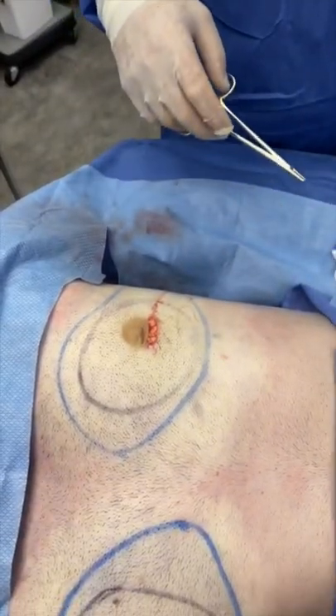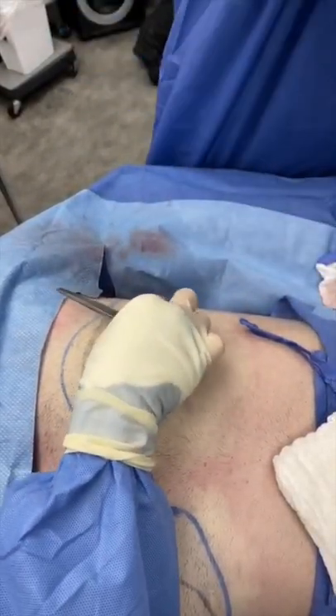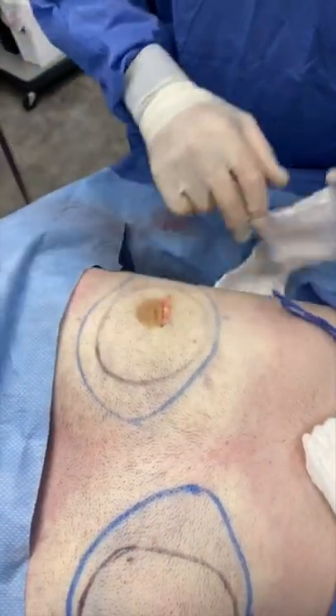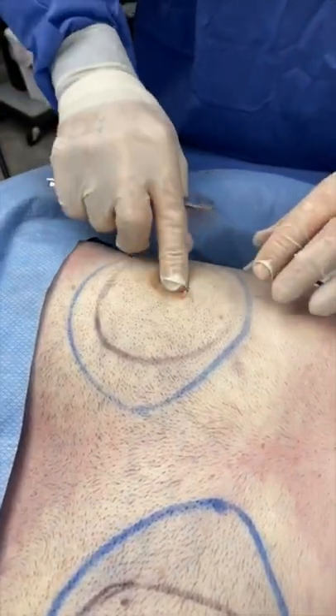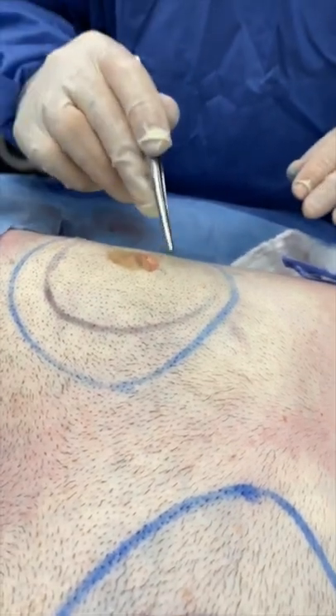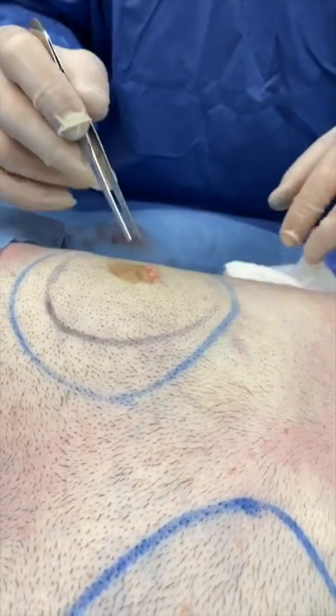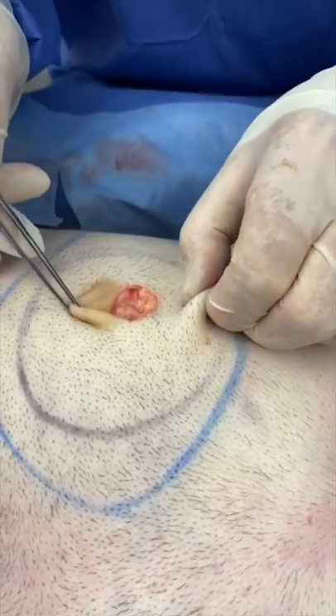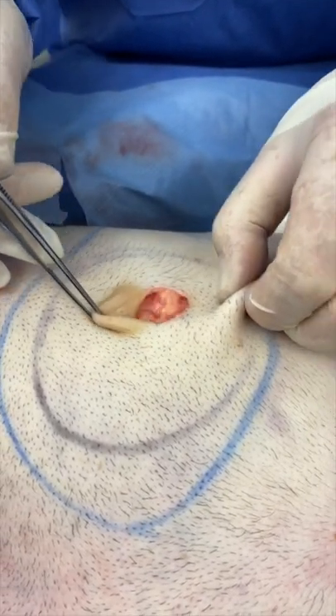What I hope you can appreciate with this video is that this area is no longer depressed. The nipple-areola complex is completely flat and is supported by this layer of underlying tissue. This is not gynecomastia tissue — this is just subcutaneous tissue.